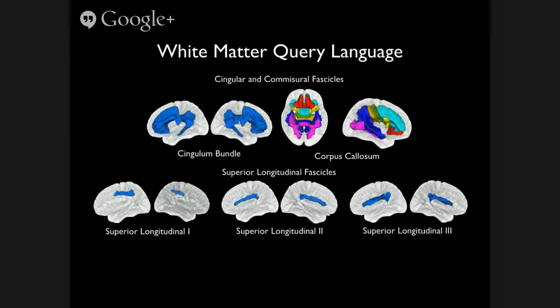But what I'm showing here is actually the isosurface of overlap larger than 99.99% on 70 subjects. On healthy tractography, you'll see that we get a nice tract. So what we did here is we followed the methodology by Deschamps et al., which is we overlap all the label maps of all the tracts generated, and then we did SPM analysis and rejected through the overlap. So this is like the 0.001 p-value surface. Everything inside was common to all subjects.